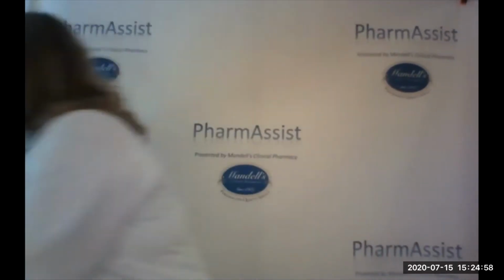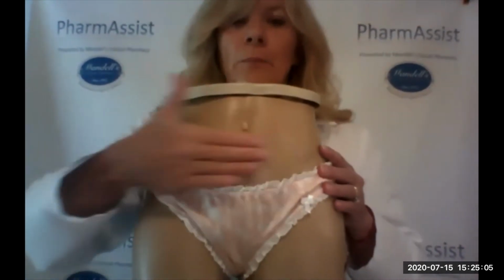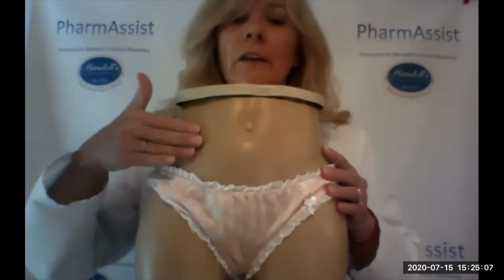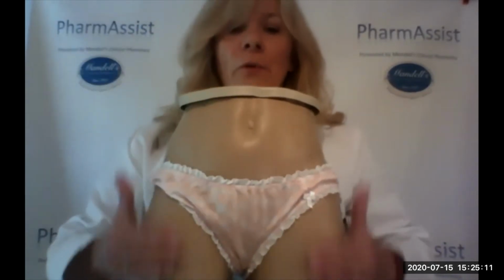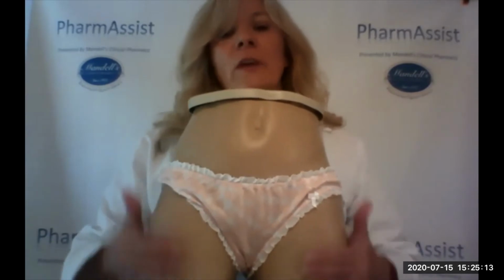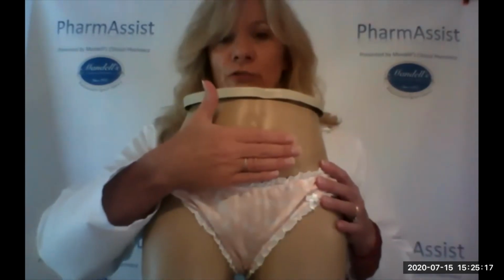For injection technique for this one, like I said, just to show you that, it will go in either the belly or the upper thigh. So just to get our little mannequin here, in the upper belly, lower belly area, not upper belly because we have some muscle up there, and in our upper thigh, outer thigh area because we have some fatty tissue. So we want to avoid muscle. This is a fatty tissue shot.